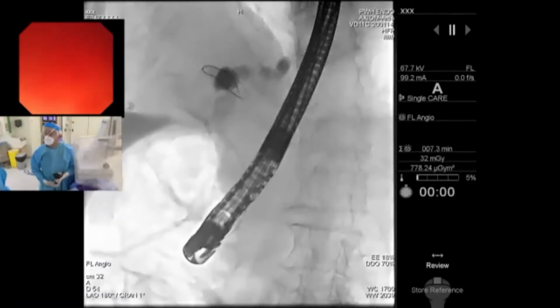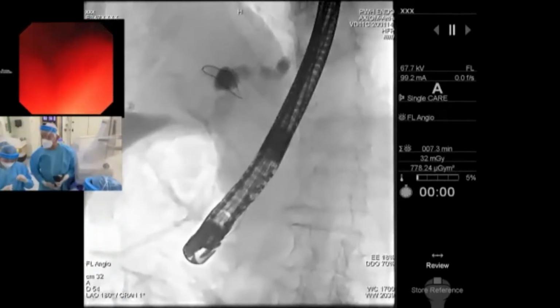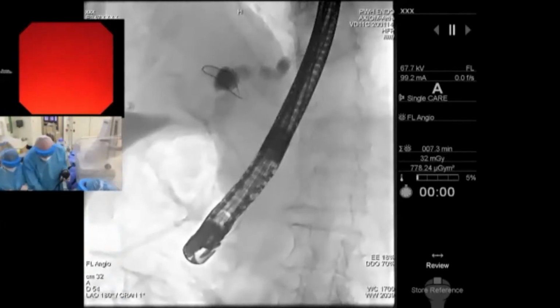There's a question, Anthony. Why not do a cholangiogram up front to see your landmark and the structure and the anatomy before going to the spyglass, if contrast is not going to bother you? Yeah, so actually I already did the cholangiogram, and the stricture is around 2 centimeters below the hilum. I think we just saw that just now. We can always do one more with the spyglass because we can inject contrast through the spyglass.